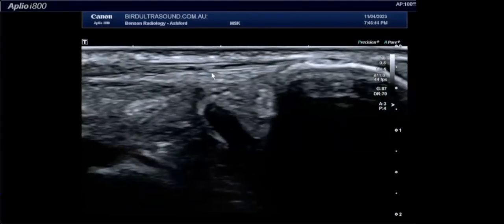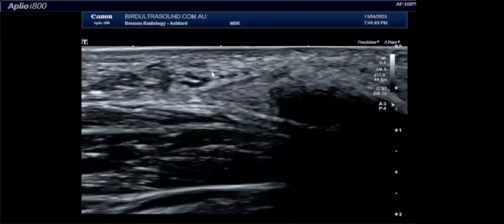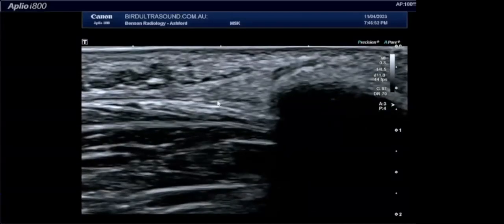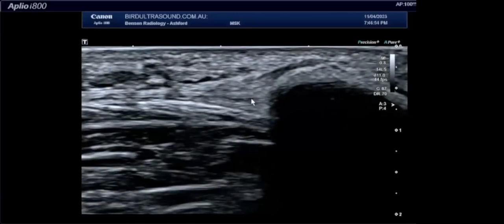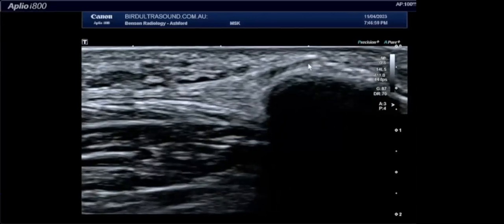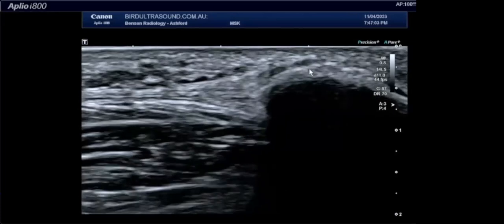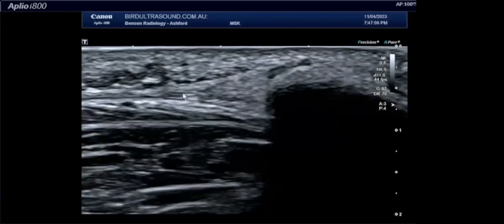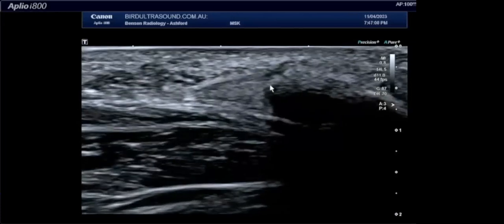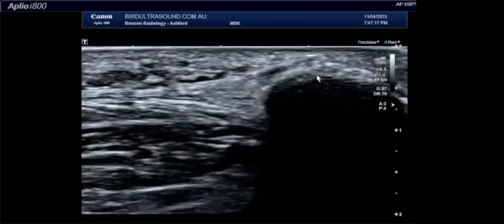And I always feel like it's worth just having a look around to the side of the base of the fifth here, and you can see this big bow tie shaped structure that opens up, this big triangle, and this is the lateral band of the plantar fascia attaching onto the fifth metatarsal base as well. And this is often where you'll see fractures coming through, because it's not so much peroneus brevis that causes the fractures of the base of the fifth, it's really this lateral band of the plantar fascia, and you can see how it has a really broad attachment. Of course, the lateral band of the plantar fascia doesn't have any muscle to release any tension, and so it's a very common cause of fractures in this location.